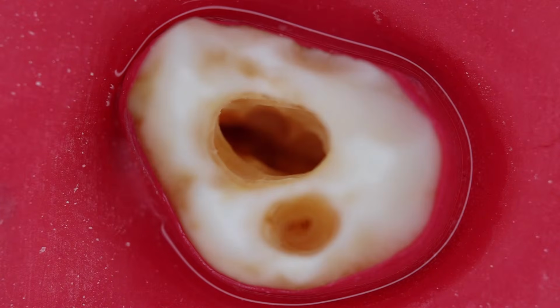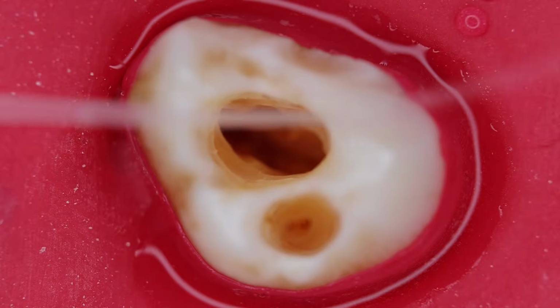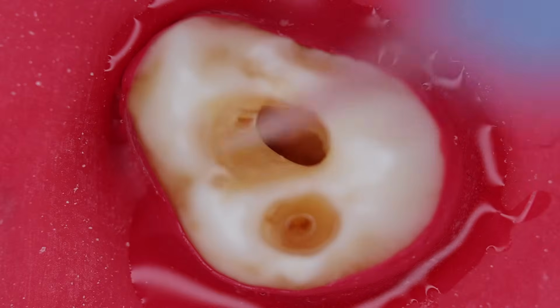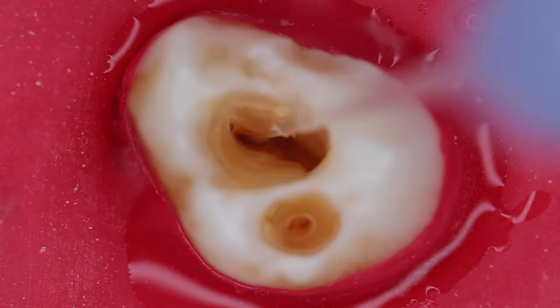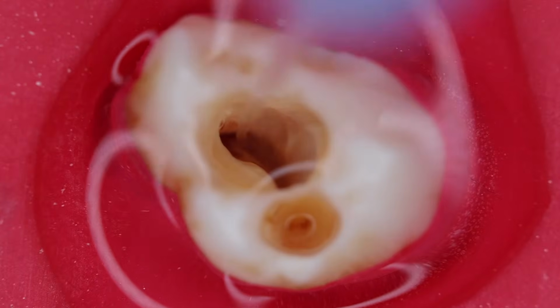Now once you have negotiated these canals and inserted the file, this is the time you introduce the irrigant. The choice of irrigant, you must start with sodium hypochlorite, and always prefer to use the side vent needle. The first choice of irrigant must be freshly poured sodium hypochlorite.